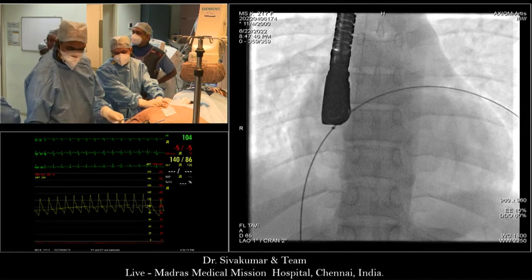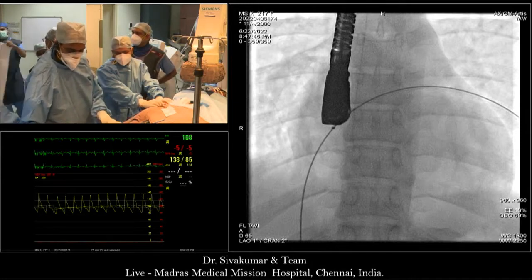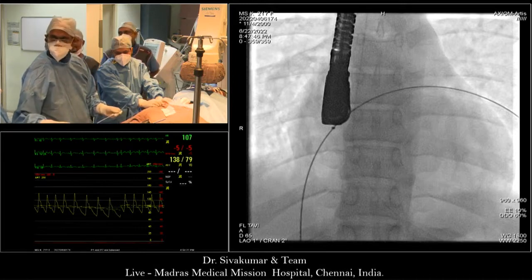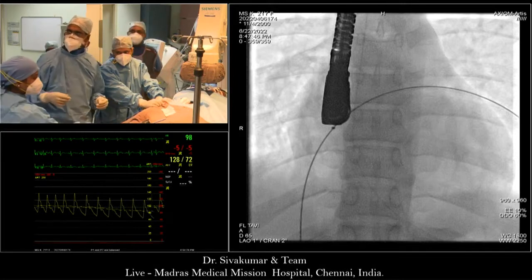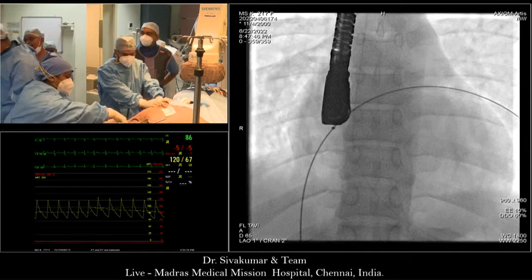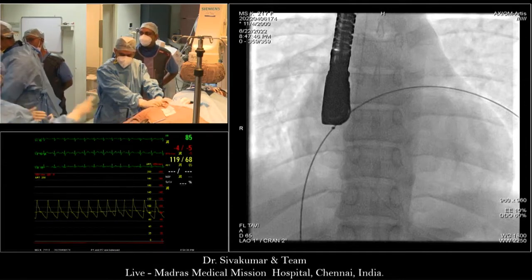I still believe that 36 was actually an okay device. I think that's going to irritate Stephen, so we're not going to ask him that. We won't let him hear that. No, but it's a good idea.